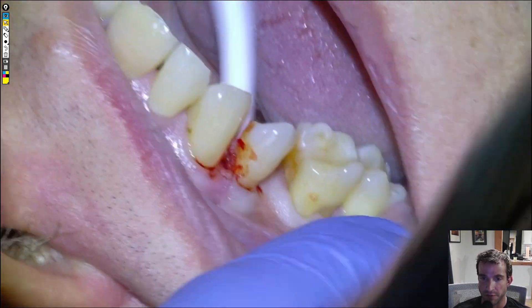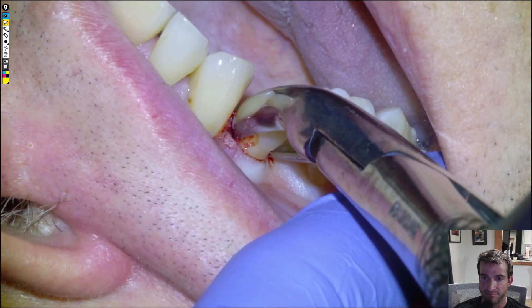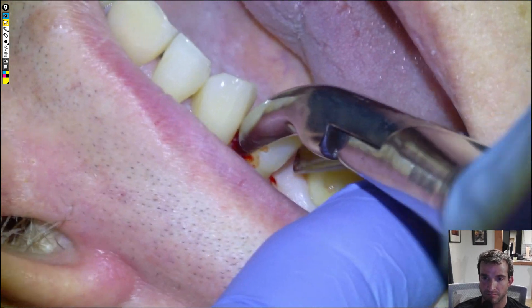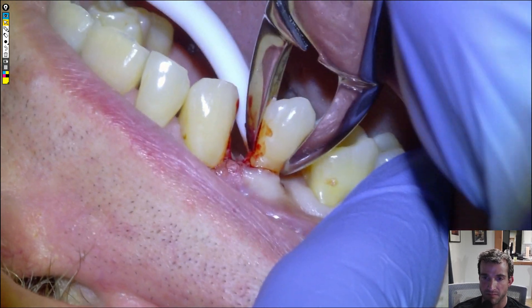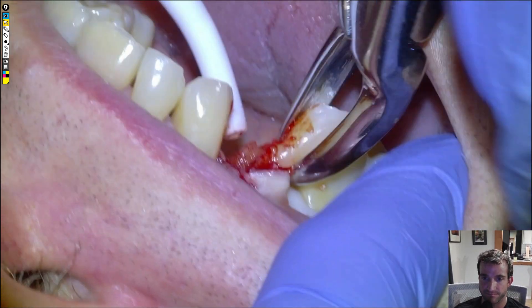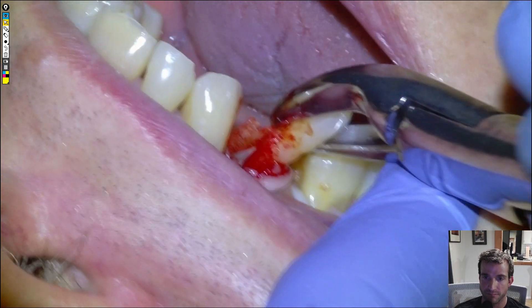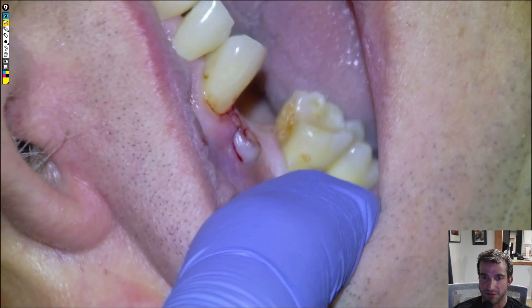We'll go in with the forceps and end up getting super lucky that the tooth all comes out in one piece. Oh, we got some bone with it — both roots came out! 'Oh perfect, yeah, that was perfect.' So yeah, really lucky — that was ideal.